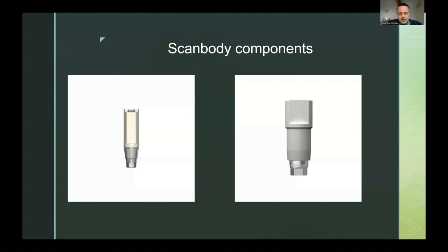The digital impression captures a mesh of the upper part of the implant, which for some implants comprises a middle section and a scannable section, while for others the whole upper part is the scannable section. The library does not always contain the whole scanbody — sometimes only the upper part, or only the flat part. It is wise to know which part your library uses, as that is the section requiring a perfect scan. If unsure, try to scan the entire scanbody as precisely as possible.